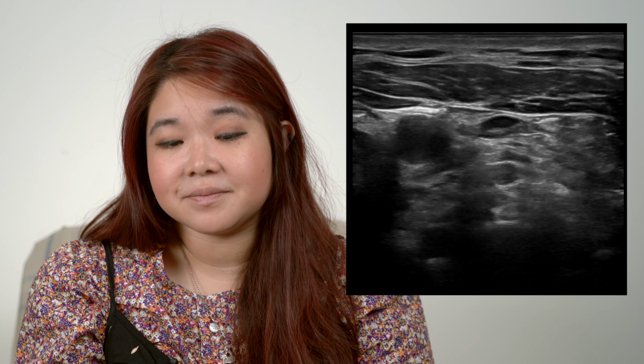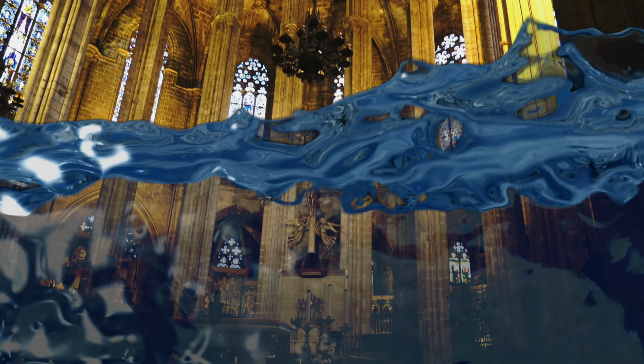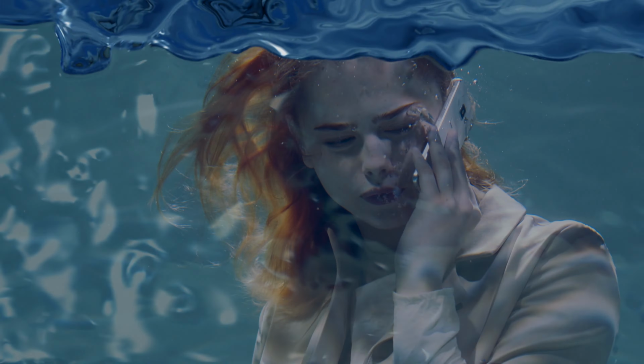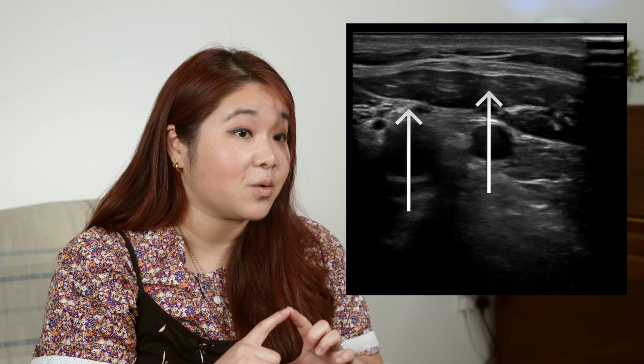Finally, flood that concert hall full of black, dark seawater. No people, no foam, just water. Any shouts will just not be heard. They're all going to be absorbed. And that is anechoic. Just like the blood in our vessels, arteries or veins, all returning images as neat little black circles or tubes, depending on how your probe is orientated.